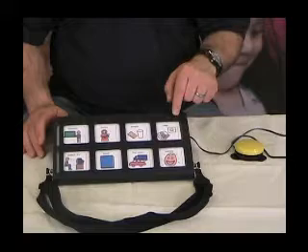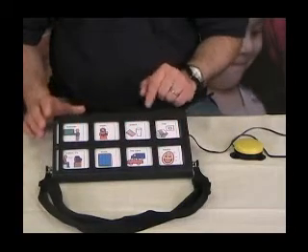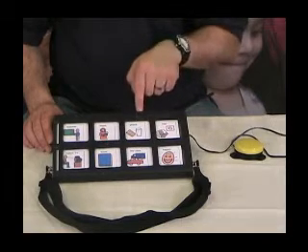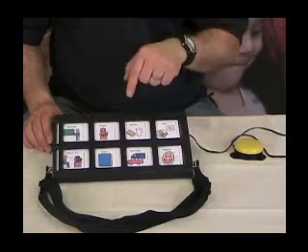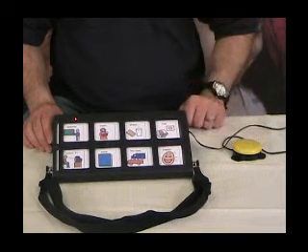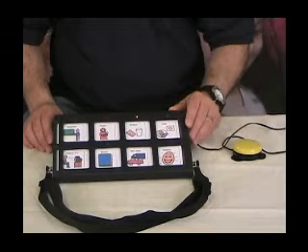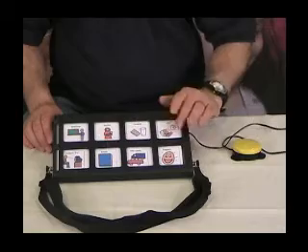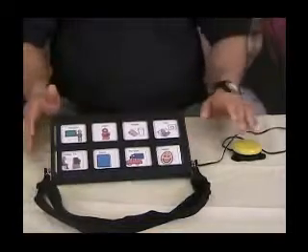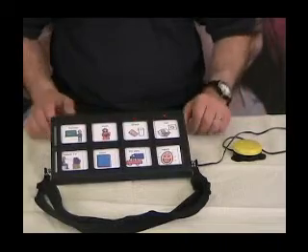The next mode is auto scan. To change modes, press cells 7 and 1 simultaneously. The machine will beep the actual number of times to indicate which mode it's on — two beeps means mode two, which is auto scan. Press the switch and release; the machine automatically advances through each icon: 'Teacher,' 'Mom,' 'Nap.' When you hit the switch again on your desired icon, it plays back the selection. You can use auditory cueing with this mode or turn it off for a visual-only experience.